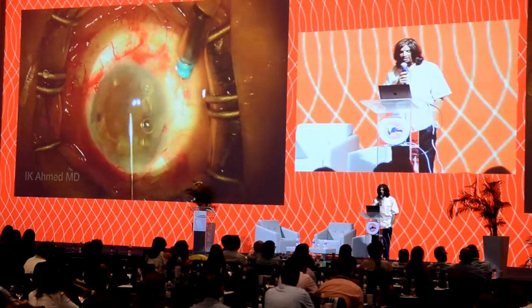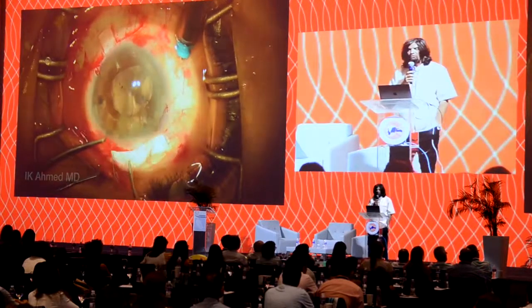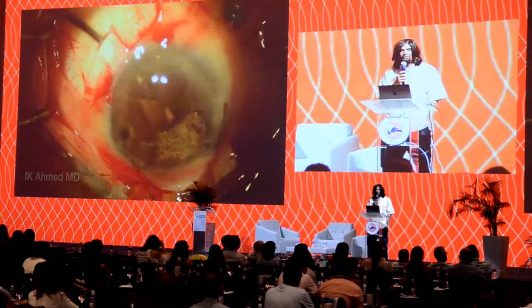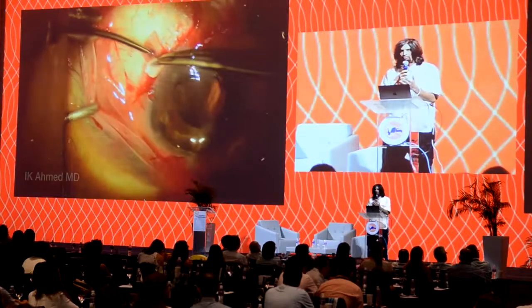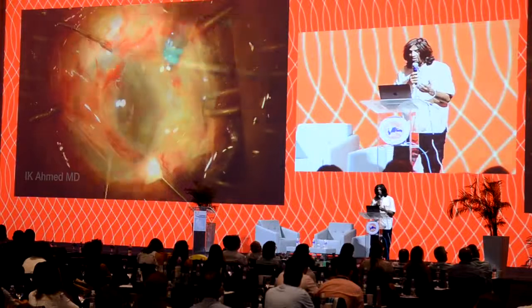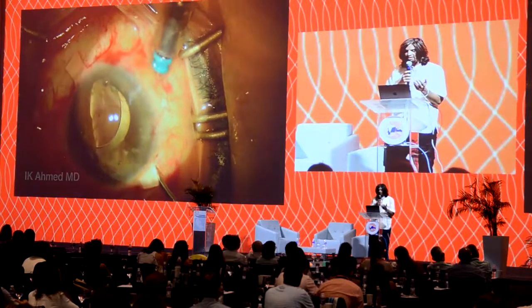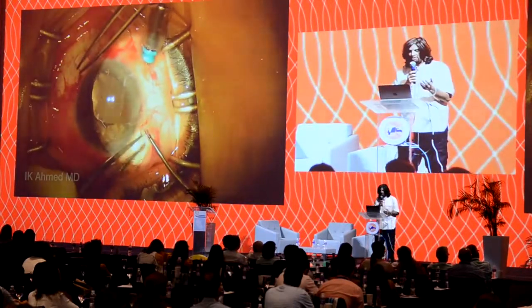And then now we can place a three-piece lens, typically a hydrophobic three-piece lens with PMMA haptics, using the well-described micrograsper to grab the tip of the haptic and pull it out. Now, we could, of course, have gone on and put in another anterior chamber lens or an iris-fixated lens or a suture-fixated lens. The cornea wasn't in the best shape, so I felt it'd be better to use this technique. And here we're basically, again, extracting the haptic out.